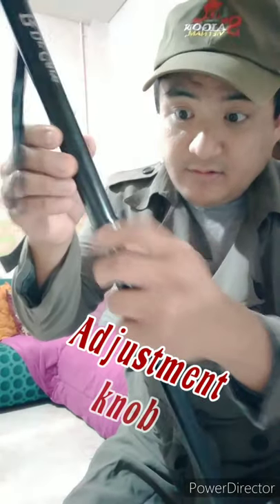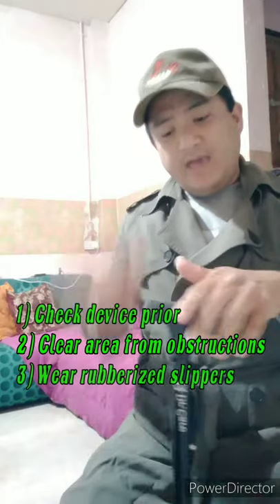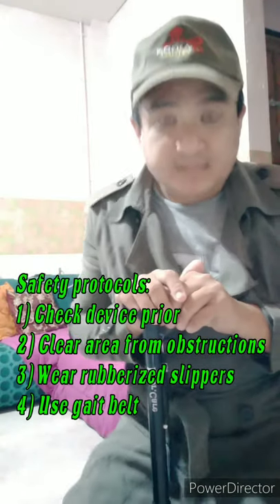This is a straight cane, as you can see. We have the handle, we have the shaft, we have the snap button — like this snap. We also have the rubber tip. In this collapsible cane, there is an adjustment knob so that it won't be removed. You just roll it to lock your device.